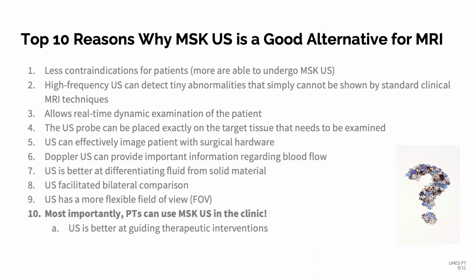And most importantly, PTs can use MSK in the clinic. Ultrasound is better at guiding therapeutic interventions. So although MRI remains the imaging preference standard for a wide range of MSK disorders, MSK ultrasound is an important technique and alternative to MRI, especially for physical therapists in the clinic.